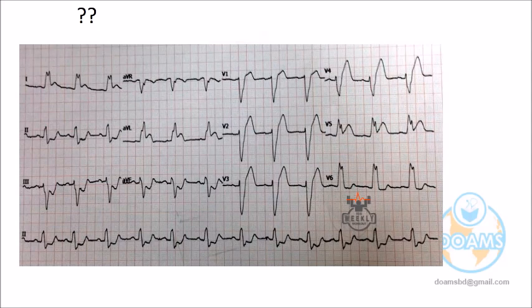But as a rule, if LBBB is there, we cannot comment on ST elevation. Very hard to comment. And it is found that if LBBB is there with chest pain, until proved otherwise, it is myocardial infarction. Without chest pain, maybe only LBBB.